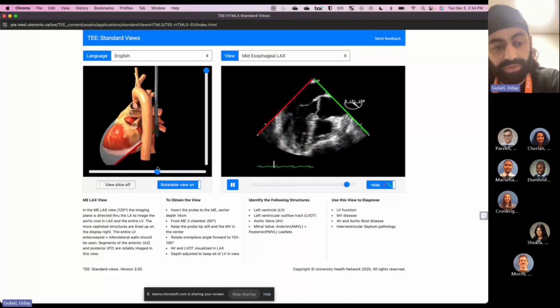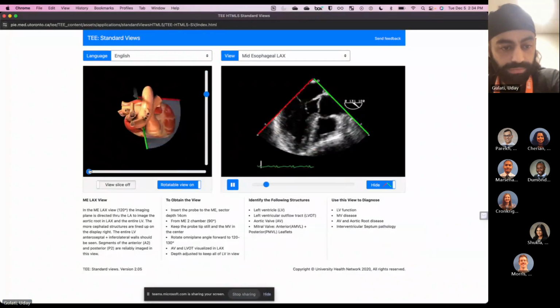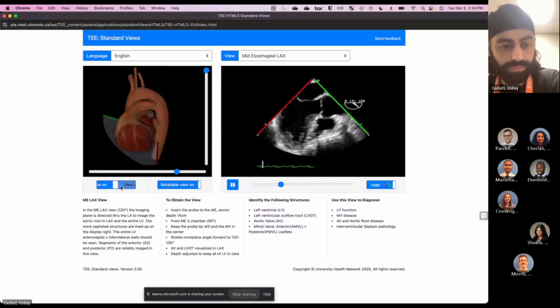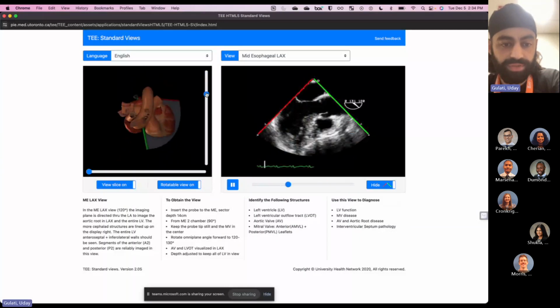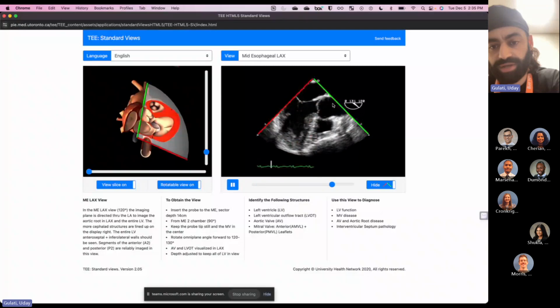And so when I look at what I'm exactly seeing, oh yeah, this way does the other way. So this is like an inverted parasternal long, right? Absolutely. That's a good way to think about it. And the reason you're doing that is because you really want that left atrium up here, the left ventricle over there, and then your left ventricular outflow tract over there.